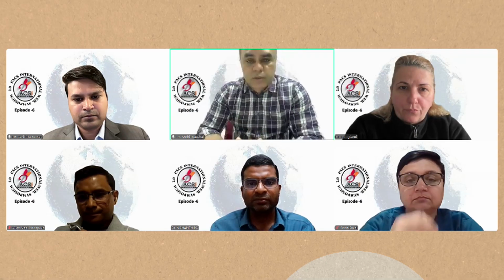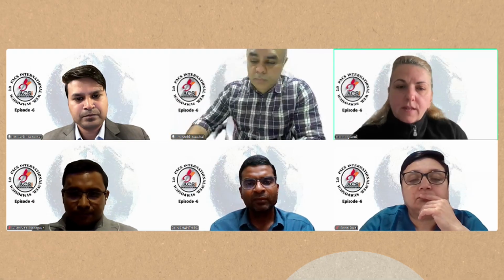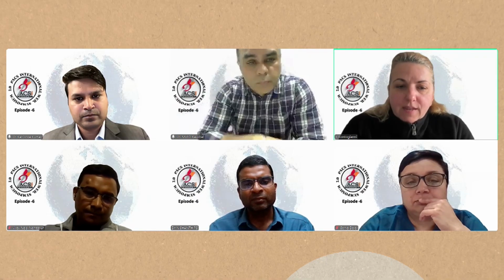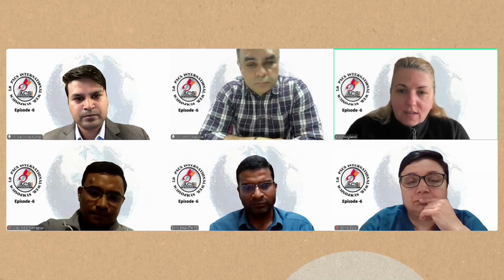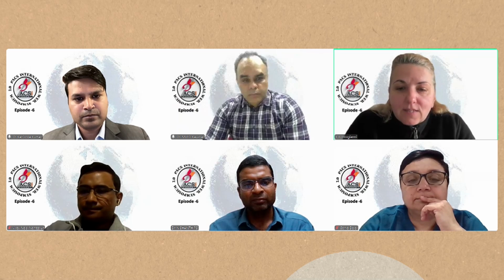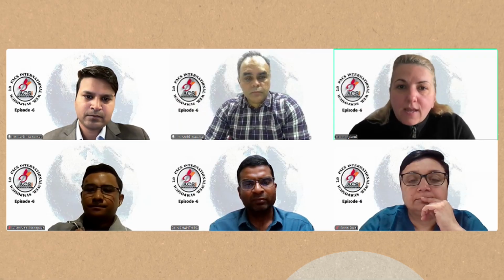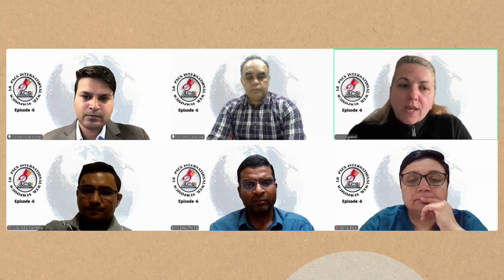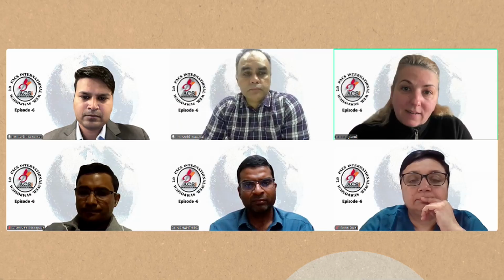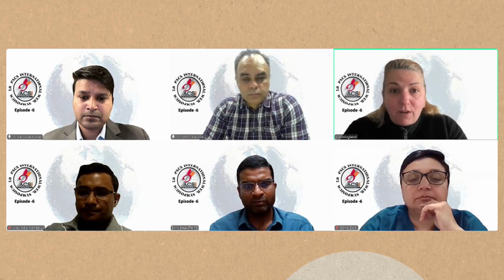So anything to add, Professor Konstantin? I think the last point was very, very interesting, and thank you for this. The indication of a bronchoscopy is the job of the bronchoscopist. So this is our job, and knowing the facts and the history of the patient and his disease and why they ask us to do this bronchoscopy, we have to decide if we continue and do it or decline because the risk is so high, and we have to talk to the patients and the family of the patient if we decline a bronchoscopy due to high risk.